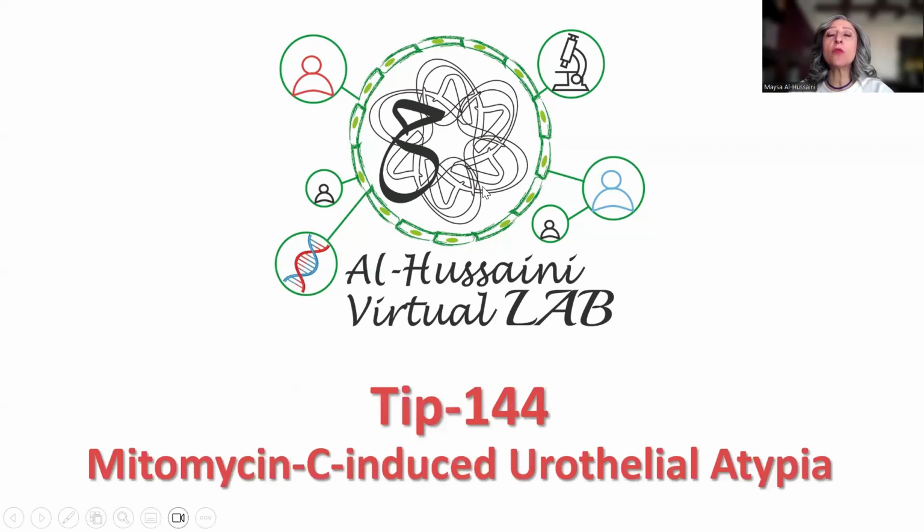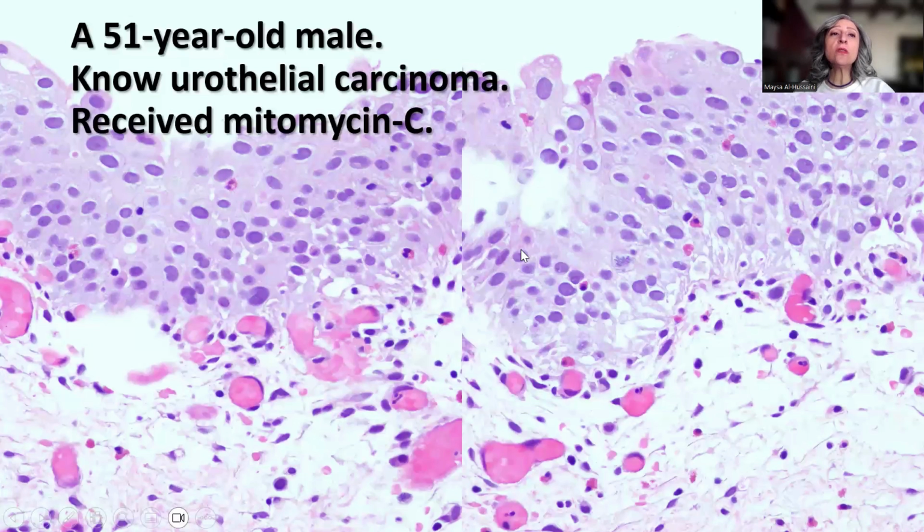What I'm going to be sharing with you is a nice tip or potential pitfall of Mitomycin-C-induced urothelial atypia. So this is a case of a 51-year-old male patient who is known to have low-grade papillary urothelial carcinoma, for which he received Mitomycin-C. And this is actually a follow-up cystoscopy and biopsy.